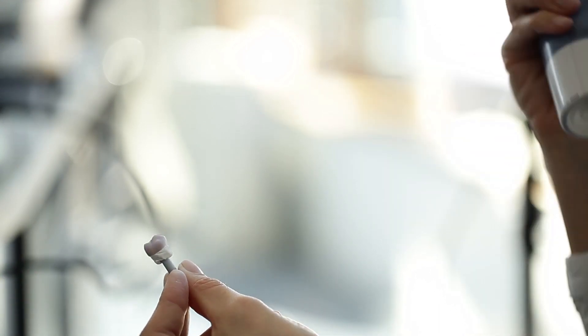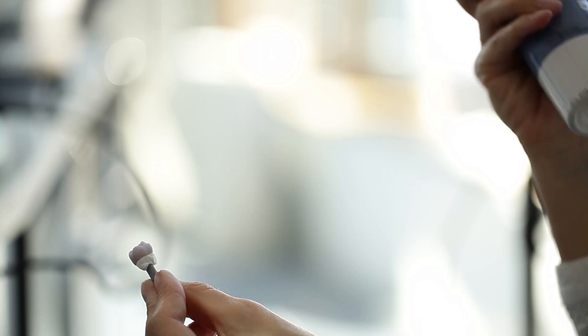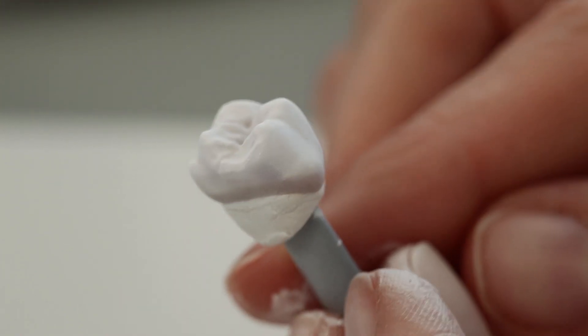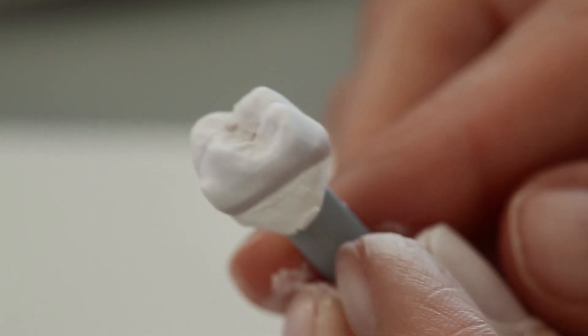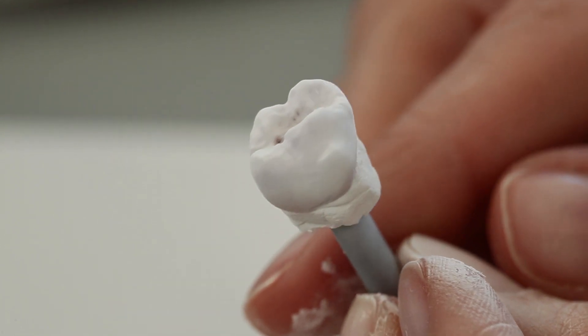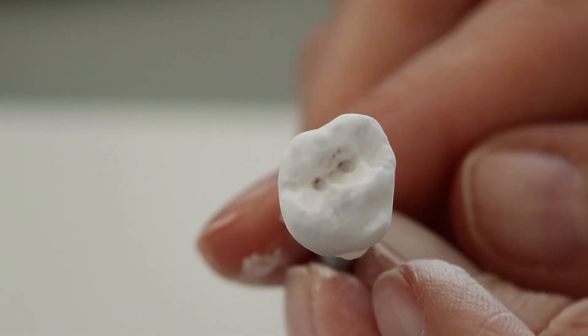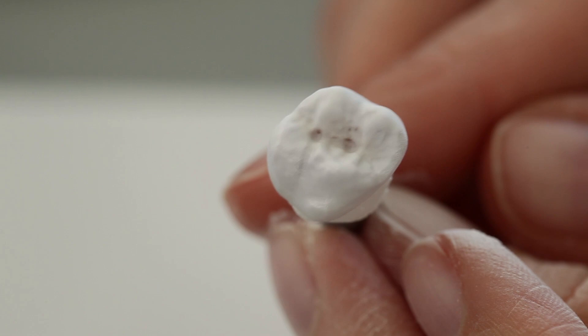Rotate the restoration to achieve an even layer. Shake the spray can between individual bursts. Allow the glaze to dry briefly until a whitish coating is visible. If the glaze layer looks irregular, spray the restoration again.